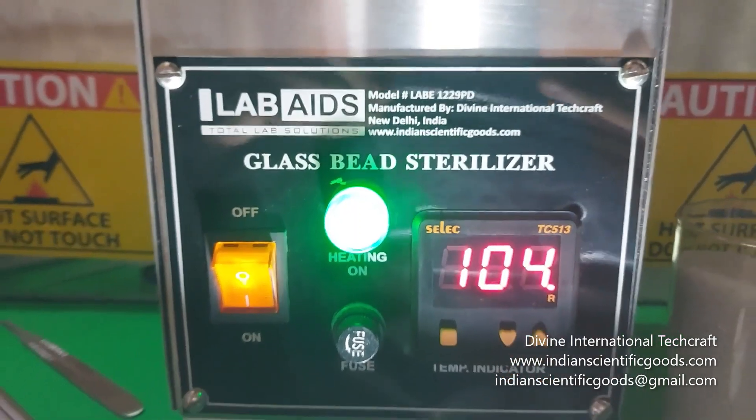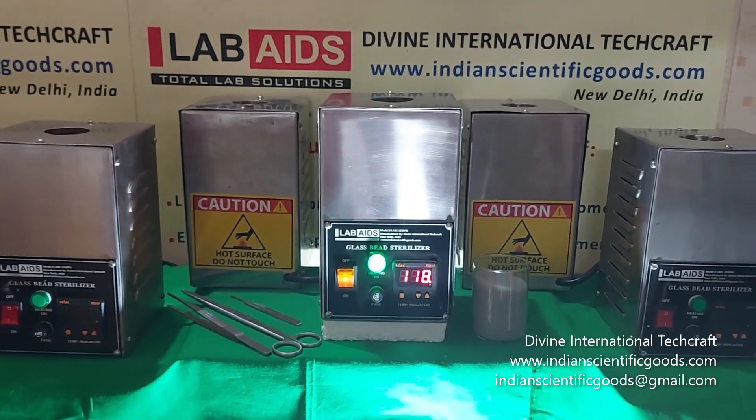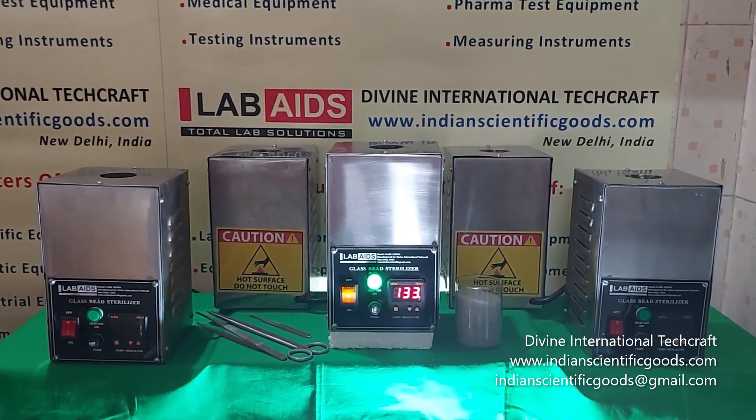These sterilizers are used by dentists, ENT professionals, dermatologists and tissue culture scientists. These units can kill most classes of fungi, bacteria and virus.